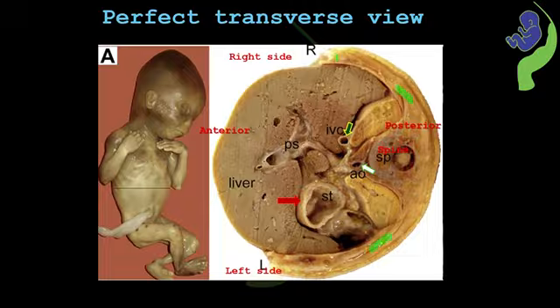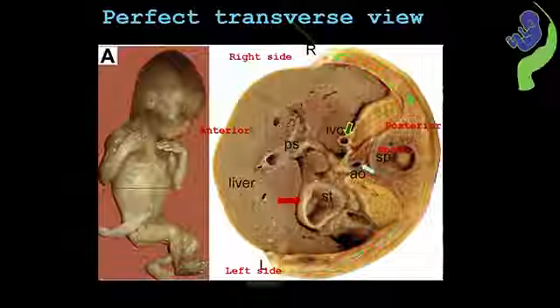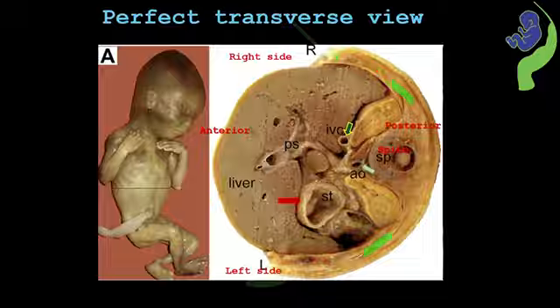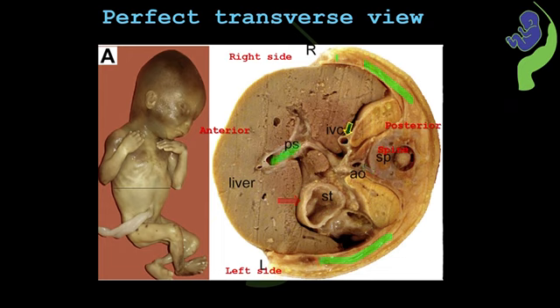Now the first criterion is that a complete fetal rib is imaged along each side of the two lateral abdominal walls. The fetal stomach is located on the left side of the abdomen. The descending aorta is imaged posterior and close to the spine and slightly to the left side from the midline. The IVC is situated more anterior and to the right from the midline. Finally, we see what is commonly referred to as the C-curve of the umbilical vein, which actually represents the portal sinus. We will discuss its details in the upcoming slides.